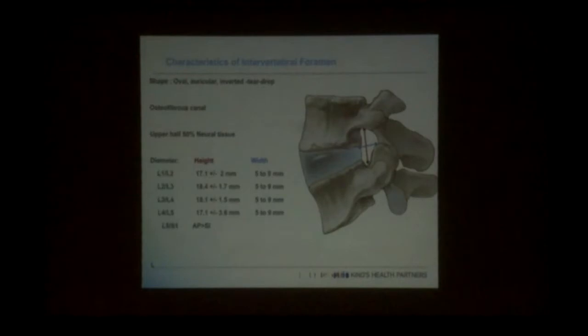And if we see now the size of these, L5S1 is where, as Dr. Zelmi was saying, it is the most difficult level to do. Because the foramina has changed, it's in reverse. The foramina is less tall and wider. So that's where you can cause the problem. So when you start in the beginning, do not try to start with L5S1. But obviously, once you become experienced, I can reassure you there's no harm in doing L5S1. You can do as good an L5S1 as L4-5. But in the beginning, do not try to do L5S1.